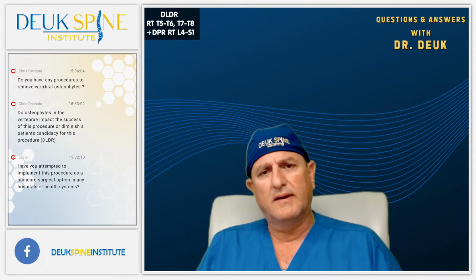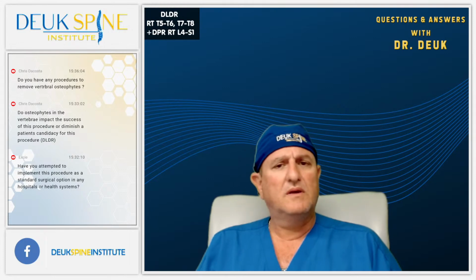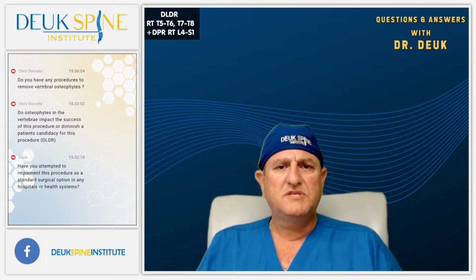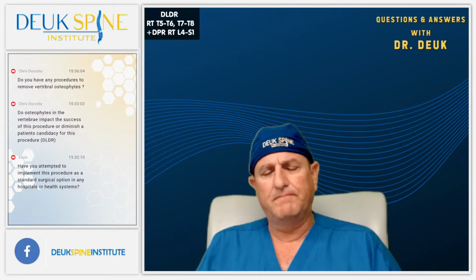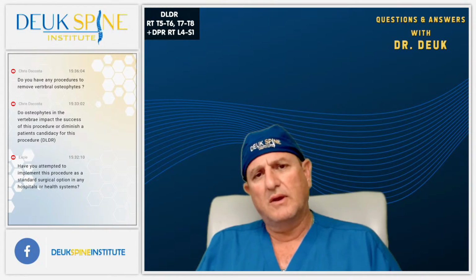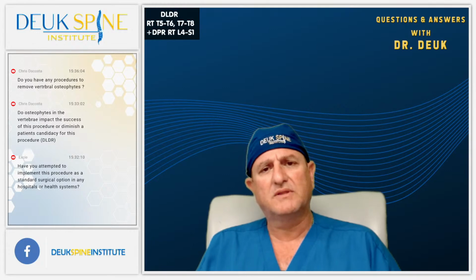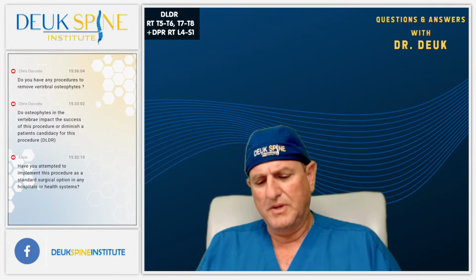We looked at her MRI. She's got, you know, literally a bunch of little disc bulging here and there, but two of them really stood out. The number T5-6 and T7-8. So when we asked her, all right, where's your pain? She pointed in that area. And today, before surgery, I actually marked out where her pain is, and we put some X's where the most pain was. And I think we got that area with the bottom disc, but the upper disc, very strange.